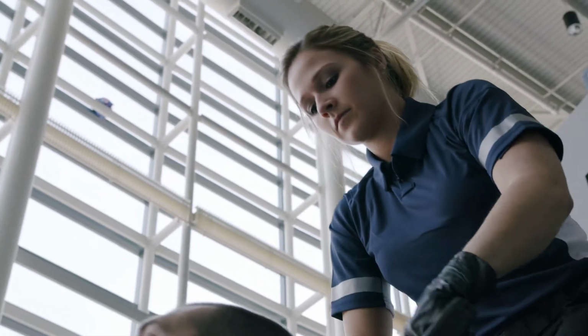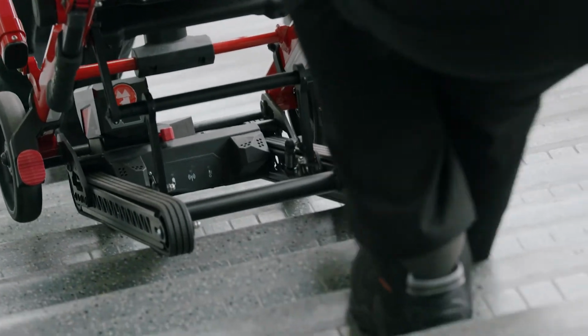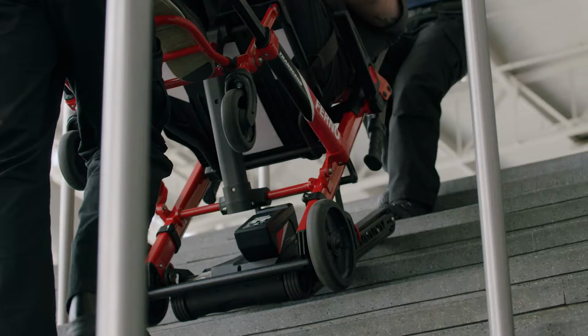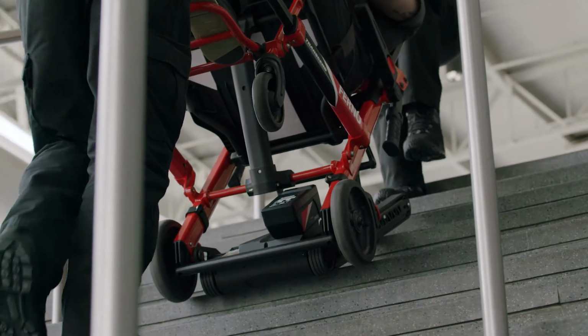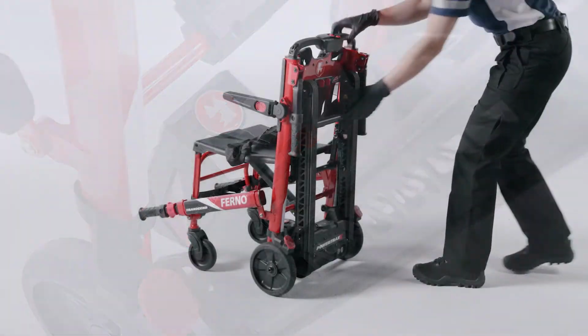Safe and proper use of this product is solely at the discretion of the user. All safety measures taken by the users should be within and under consideration of applicable regulations and local protocol. Prior to using the Transcend chair, make sure the patient restraints and any accessories are installed according to the instructions in the user's manual.